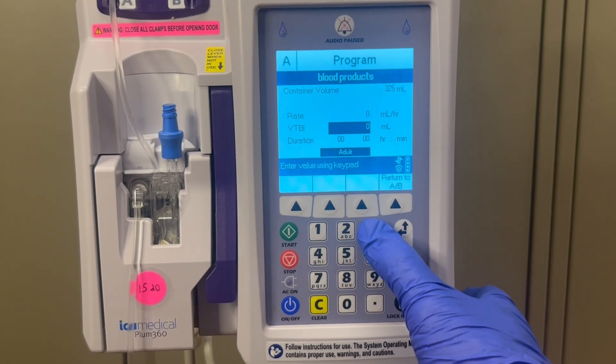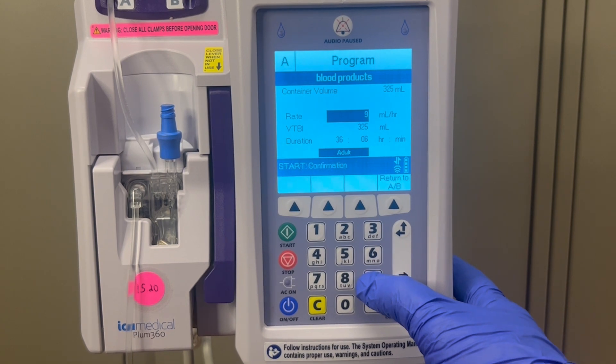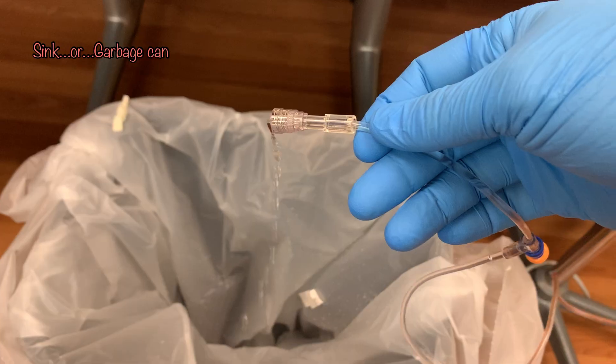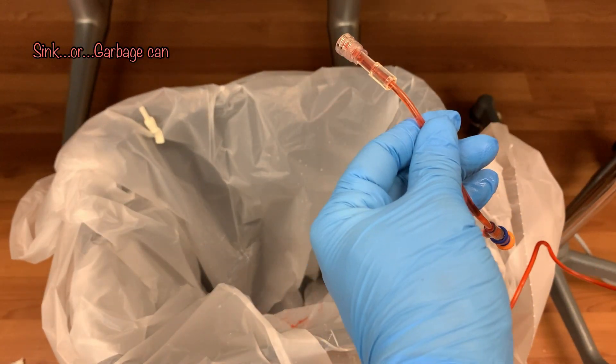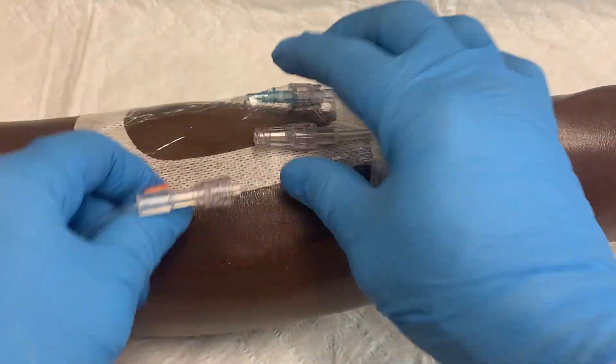First enter the volume to be infused, which is the same as the volume of the blood bag. Then for the rate, enter 999 and start. You can drain the fluid into a sink as you wait for the blood to reach the end of the tubing. As soon as the fluid at the end of the tubing is colored slightly red, stop the infusion pump and attach the IV tubing to the patient's IV.